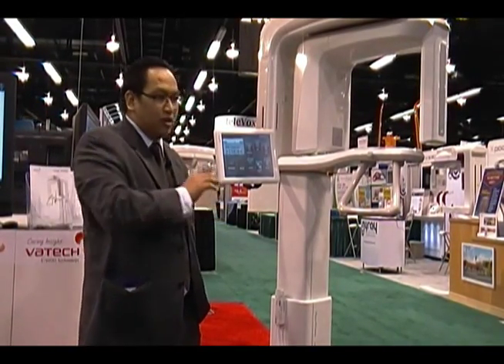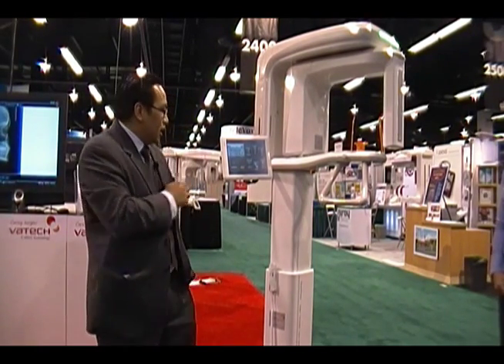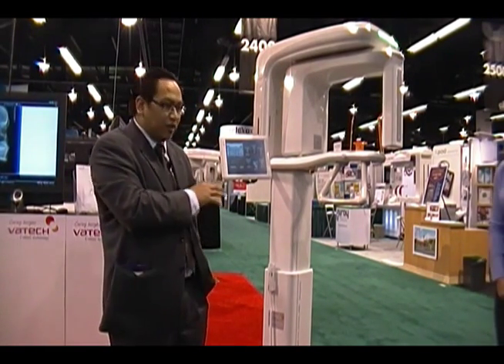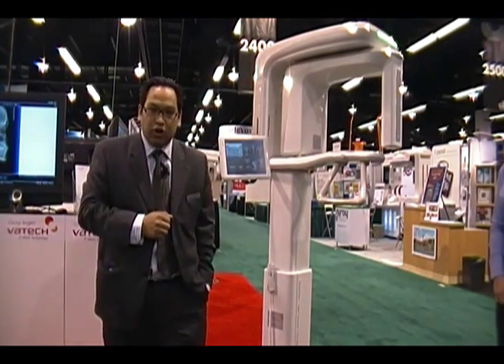For the standard pan option, you take a 9.5-second scan or a 13.5-second scan for high resolution. Again, this unit can be operated with a PC or without a PC. If operating without a PC, it is a standalone machine. Or you can tie it into the network by plugging in your Cat5 cable, and the data can be shared throughout the rest of your operatories.